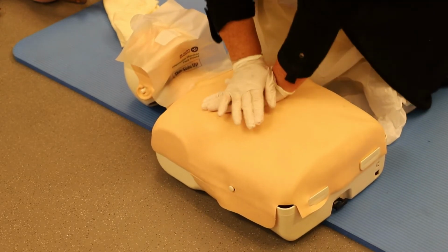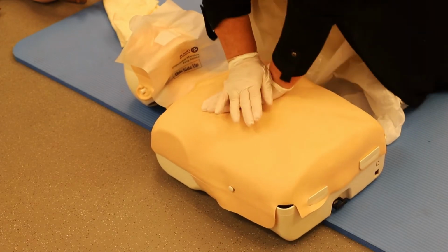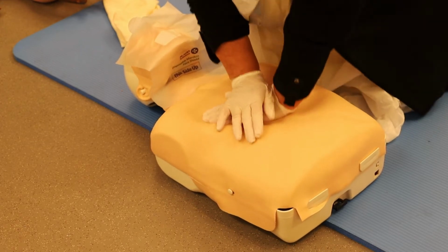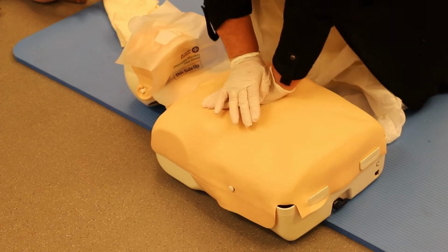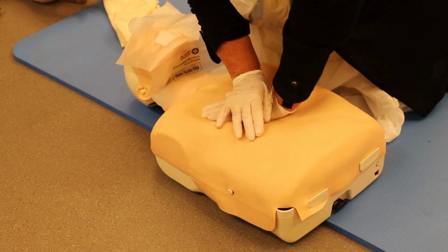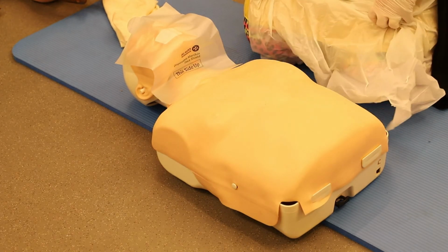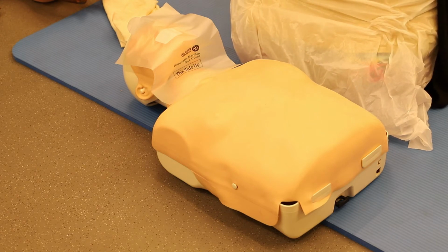1, 2, 3, 4, 5, 6, 7, 8, 9, 10, 11, 12, 13, 14, 15, 16, 17, 18, 19, 20, 21, 22, 23, 24, 25, 26, 27, 28, 29, 30. You would continue this procedure until the ambulance people arrive. Okay? Now I'm going to show you how to use the defib.